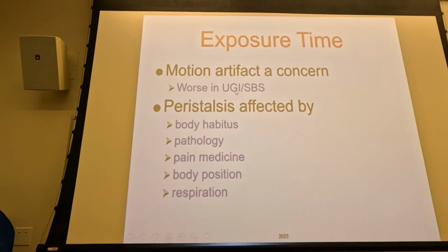Motion artifact, we already talked about that. Peristalsis is going to be affected by body habitus, pathology, pain medicine, pain itself, right?